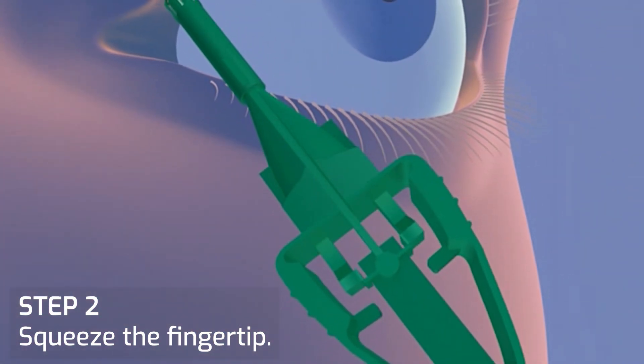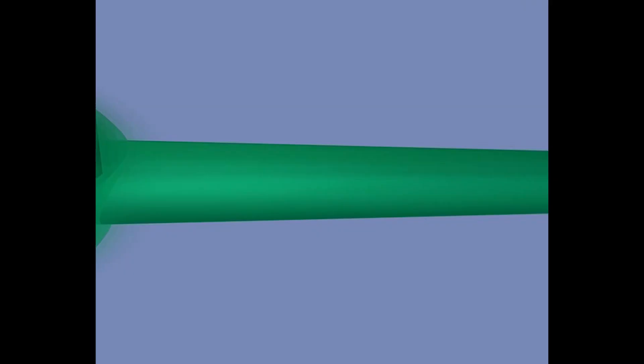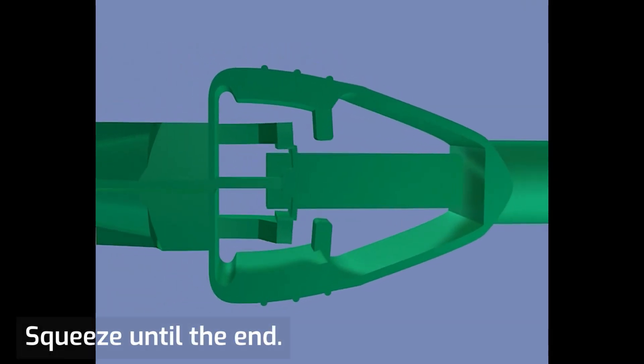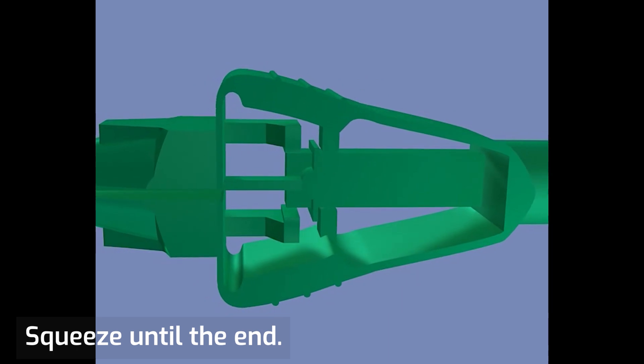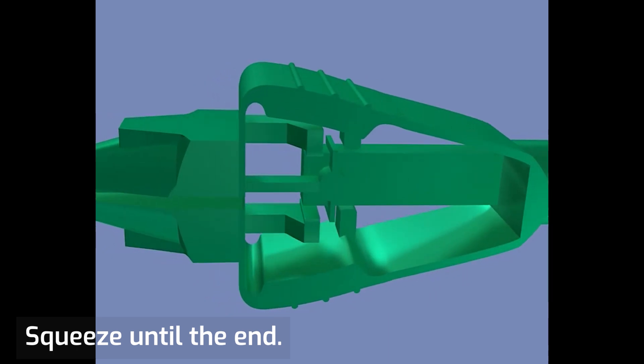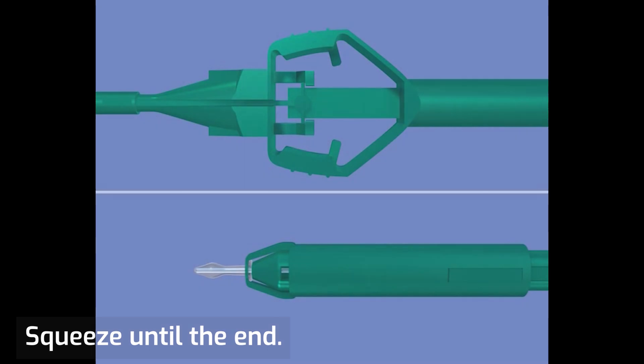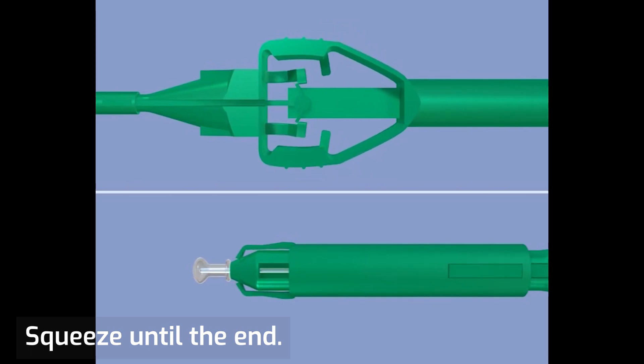Squeeze the fingertip controller until you have achieved full contact between the arms and the body of the plug inserter. It is very important to completely squeeze the fingertip controller before and while removing the plug inserter from the plug.